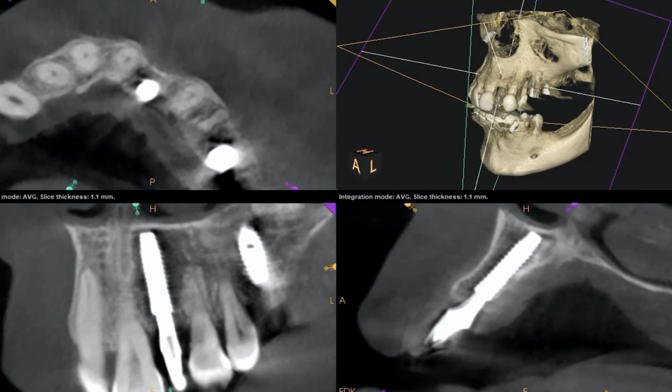But, you know, again, if I was really being nitpicky, I wouldn't mind it if that implant, for style points, was maybe 0.5 millimeter more buccal. And so I like that. So in terms of outcome, in our retrospective analysis of our surgery, I'm happy with the outcome. I think the implant is in a good position. Its restorative position is sound. Its position relative to bony boundaries is going to be good for the long term.